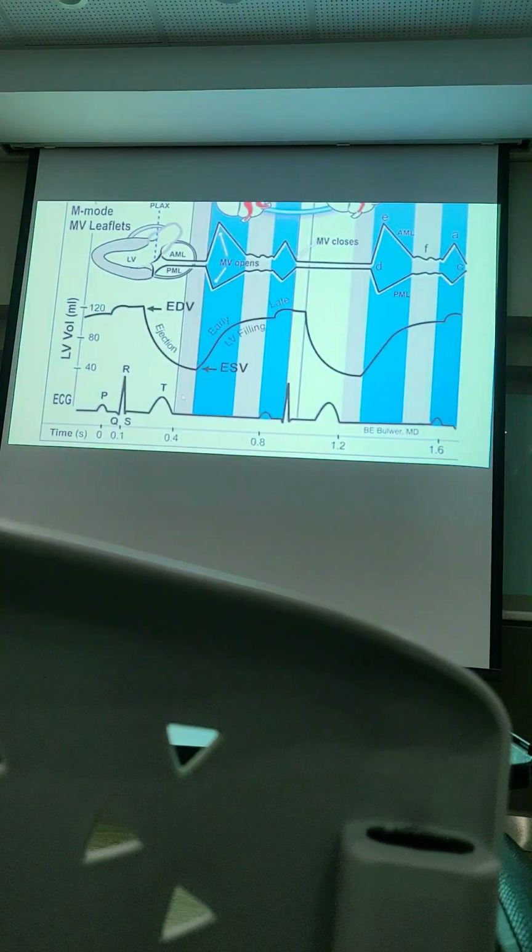So the relation of the phases to the ECG is also quite important. Just remember that diastole begins at the end of the T wave and finishes just before the R wave.